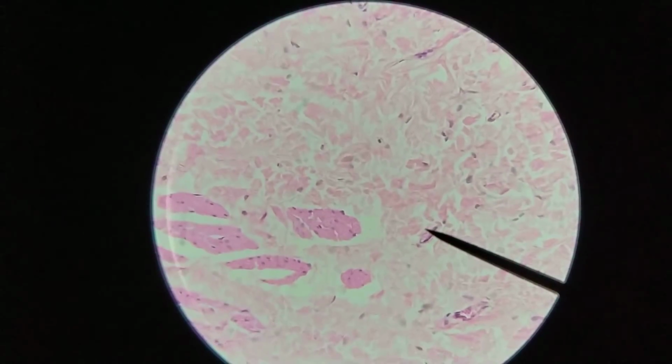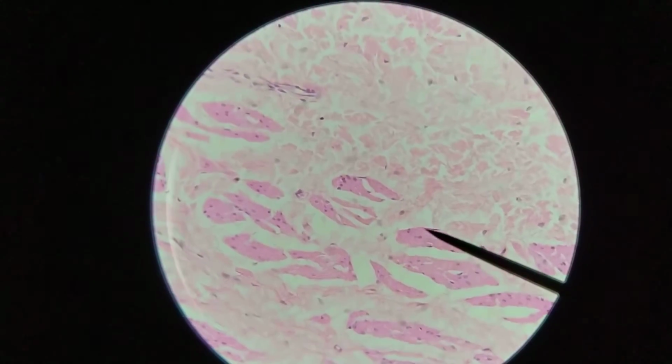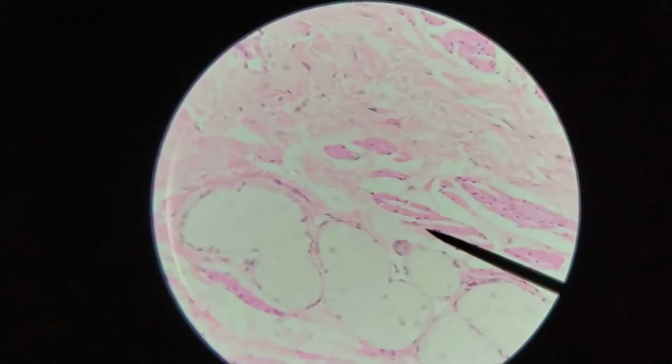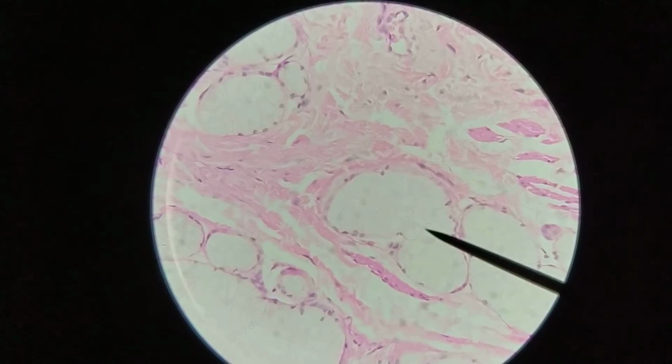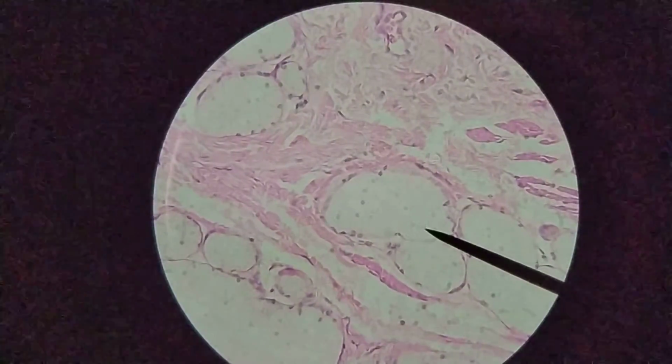As we go a little deeper here, we start to see some muscle. This is the muscularis mucosa, the more eosinophilic material. And then beyond that, we have some of those submucosal glands I mentioned earlier. Let me see if I can increase the contrast a little bit so we can see more of the boundaries of these cells.